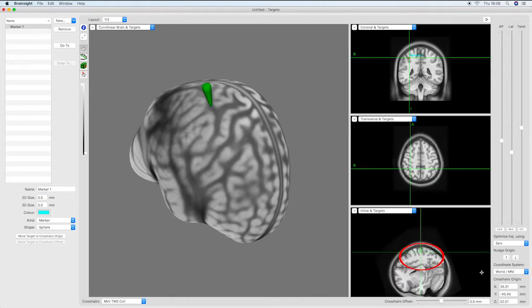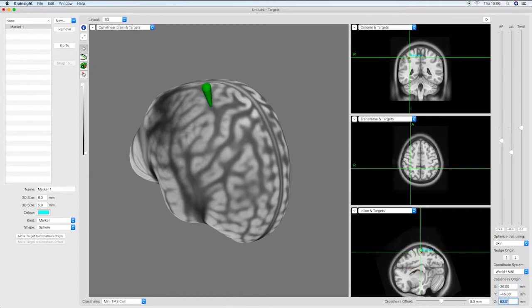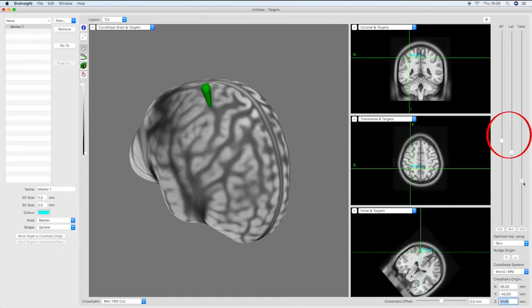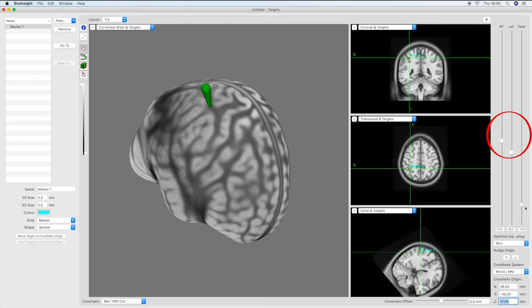This will optimize the trajectory based on the skin curvature directly above the intended cortical target. Manual changes can be made using the sliders on the right, including coil twist which is not automatically optimized.